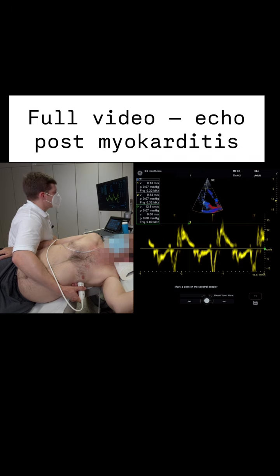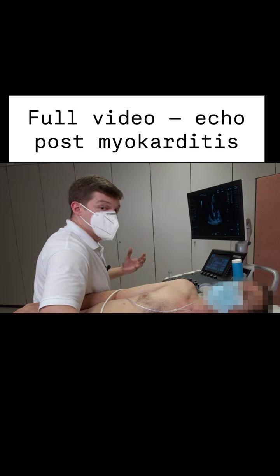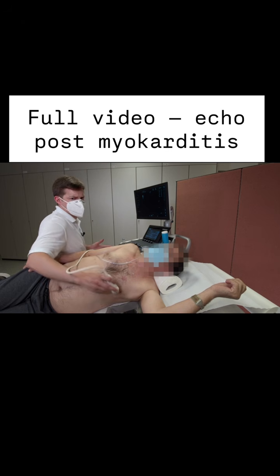More measurements would include, for example, the right ventricular strain to really identify if there are regional wall motion abnormalities in the right ventricle. To conclude our exam, we have to visualize if there is a pericardial effusion. So far we didn't see any signs of it.